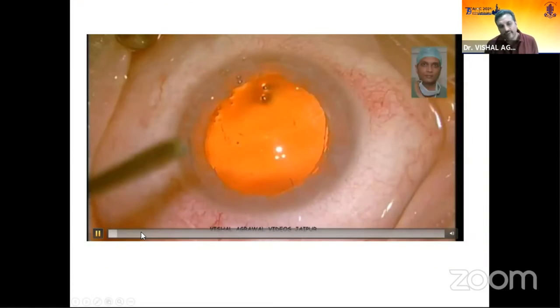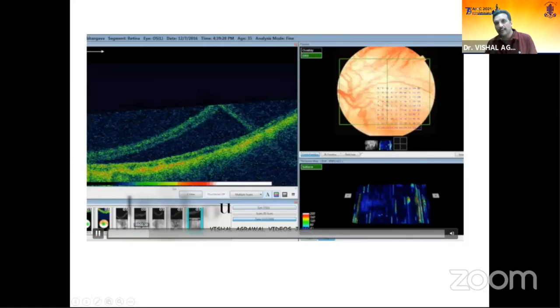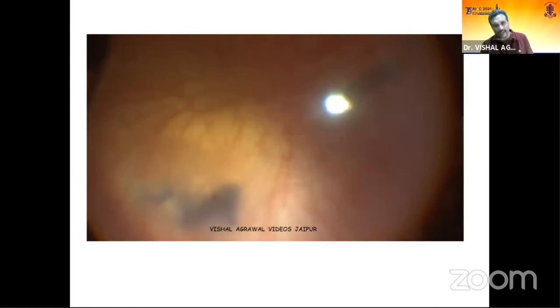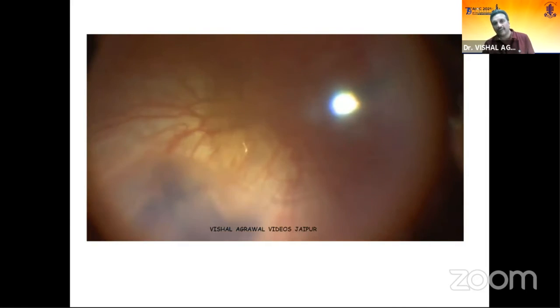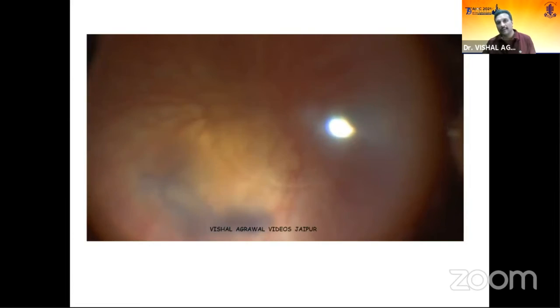One more high-reflection case is an albinotic fundus. The key here is making final adjustments in your ISO settings, white balance, and illumination settings so that there are no reflections and you can see the vessels even in a low-contrast setting like an albinotic fundus.